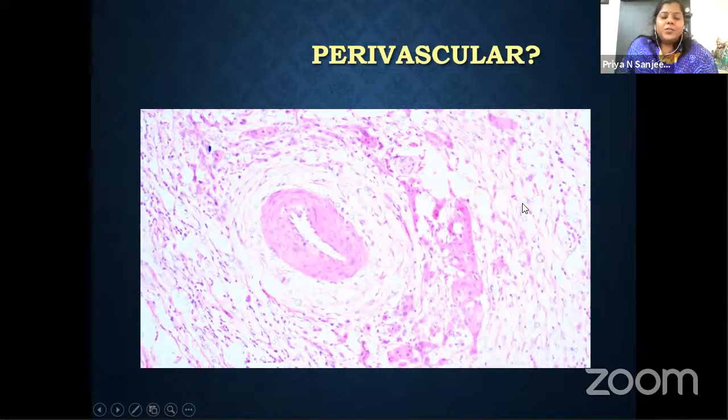And you should also know the term intravascular invasion, where the tumor cells invade the layers and are sitting inside the lumen. So that is more significant to mention: intravascular invasion. Here it is not perivascular. The islands are no doubt surrounding the blood vessel, but it is not exactly perivascular invasion. There is a good rim of normal tissue, and the tumor islands are surrounding the blood vessel.